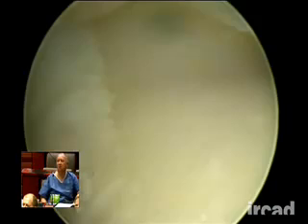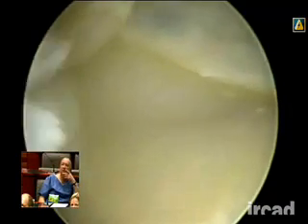Alejandro, Christoph speaking. I would like to know if you use a burr and what size of burr you use? This is a 2.9 burr, which is now a Badia burr. This one is from Dionix. It's longitudinal. It's not the round burr because it makes the procedure a little faster.